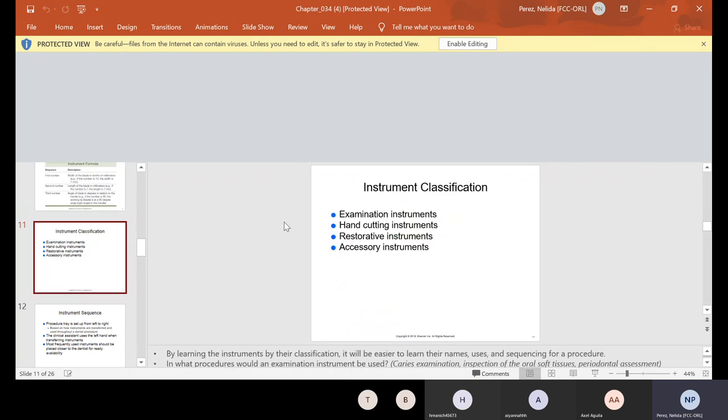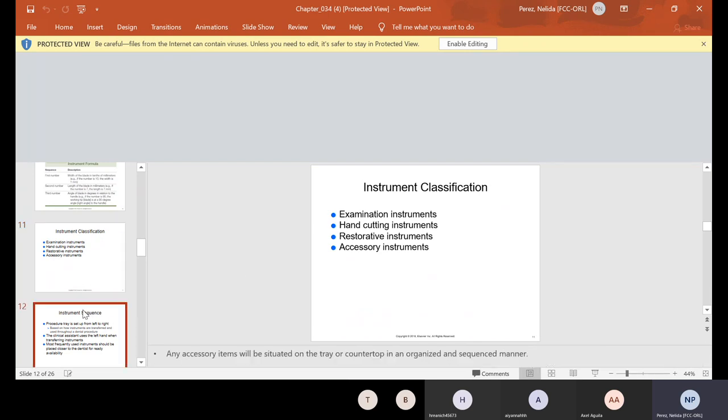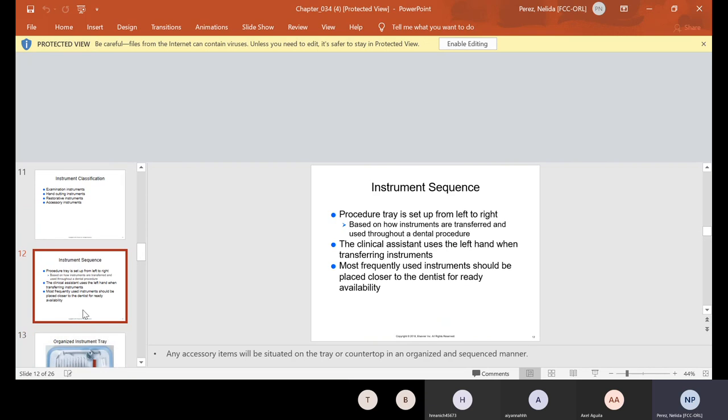Now, we're going to talk about instrument classification. We have our examination, hand cutting, restorative, and accessory. So there's a sequence. And when you set up a tray, you set it up from left to right based on how instruments are transferred and used throughout a dental procedure. The clinical assistant uses the left hand when transferring instruments. Most frequently used instruments should be placed closer to the dentist for ready availability.